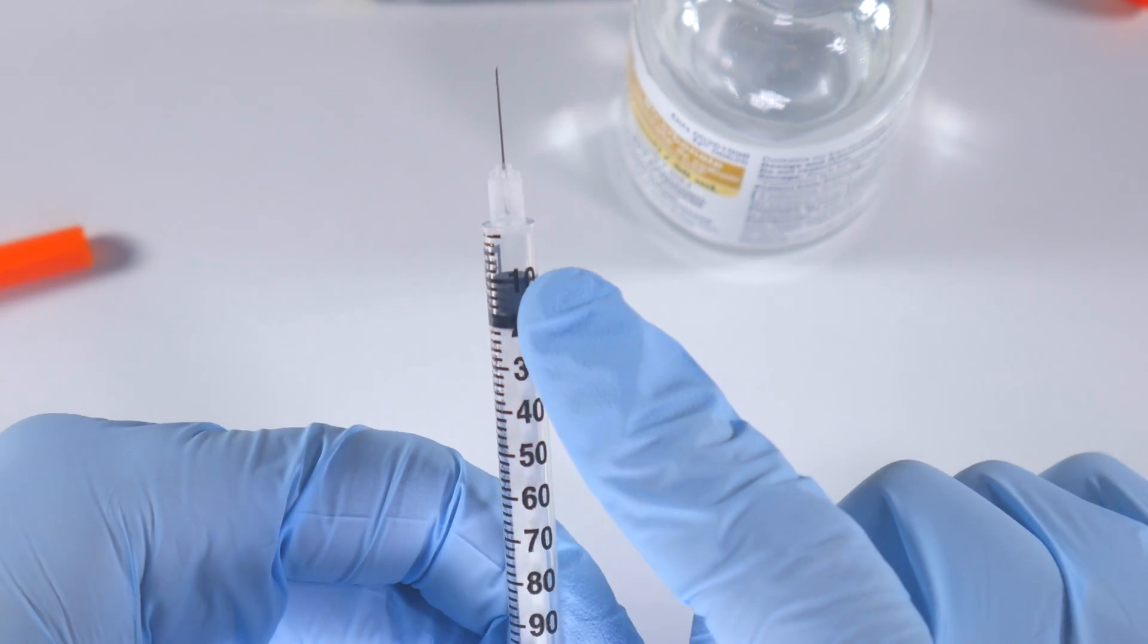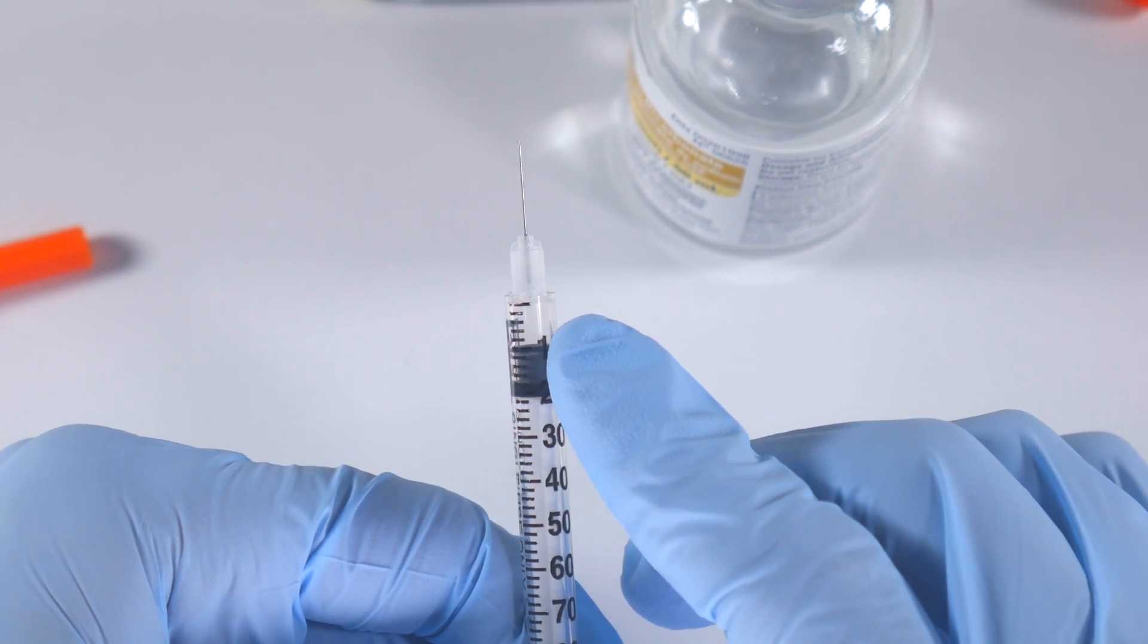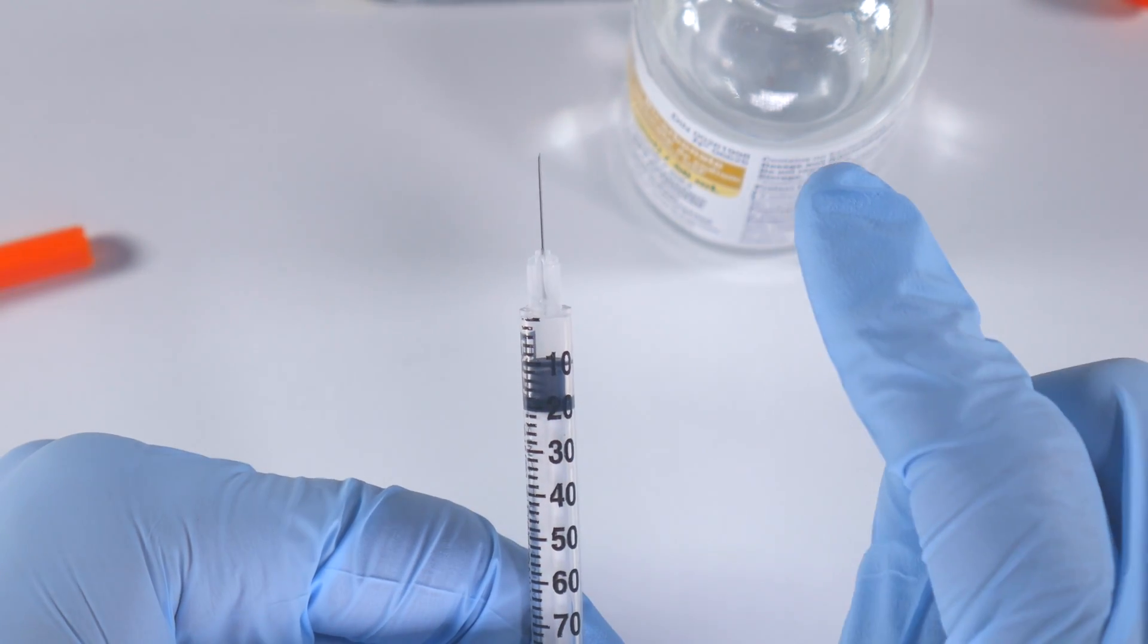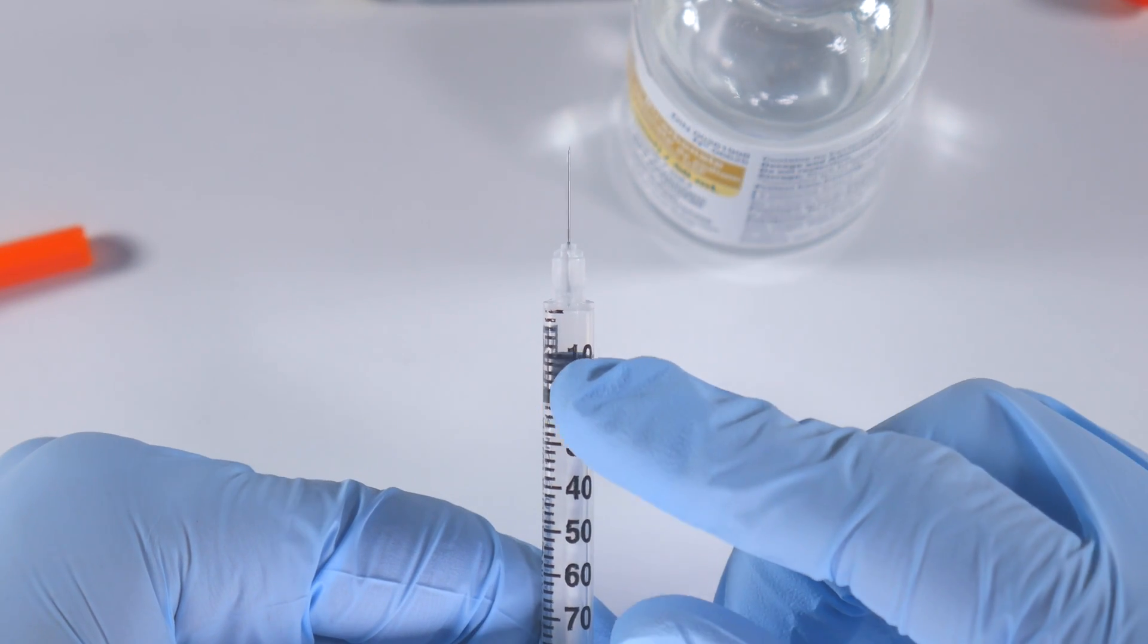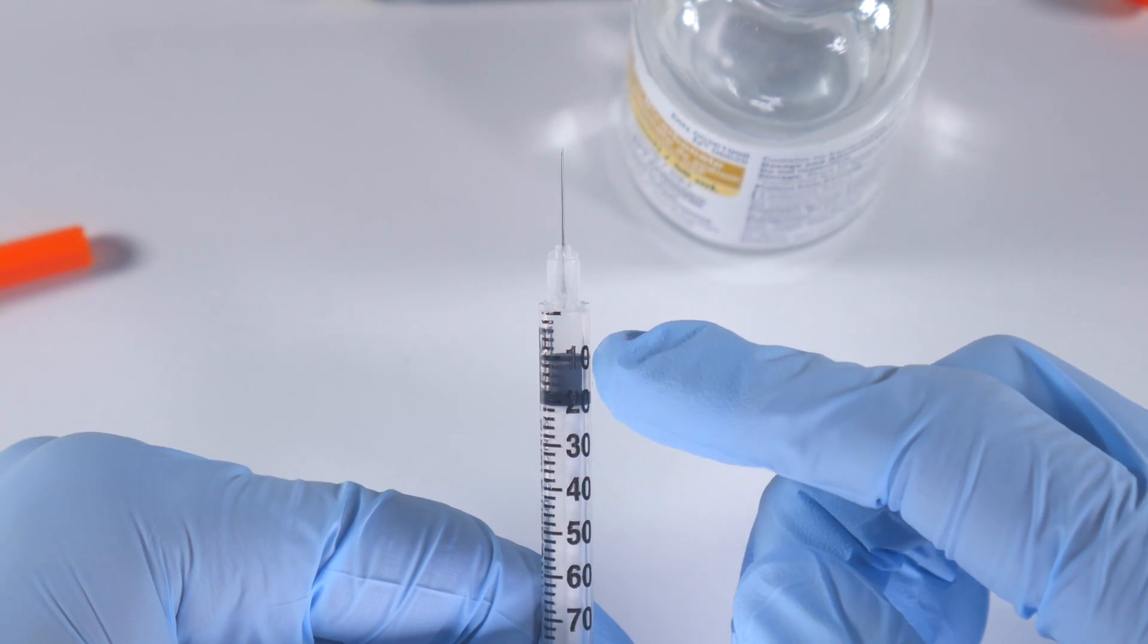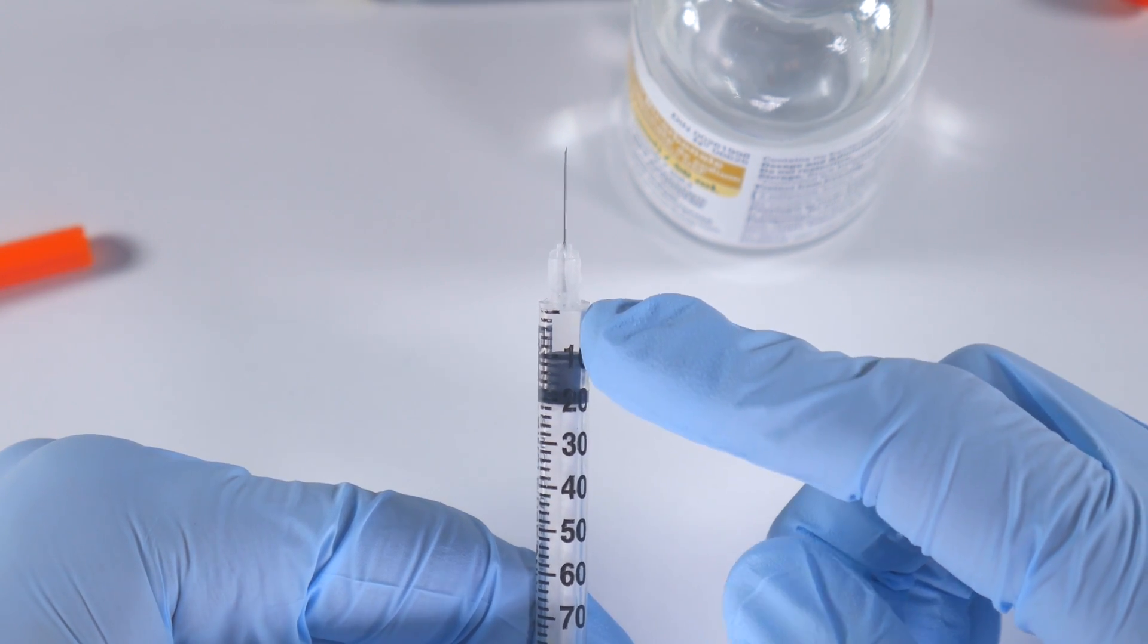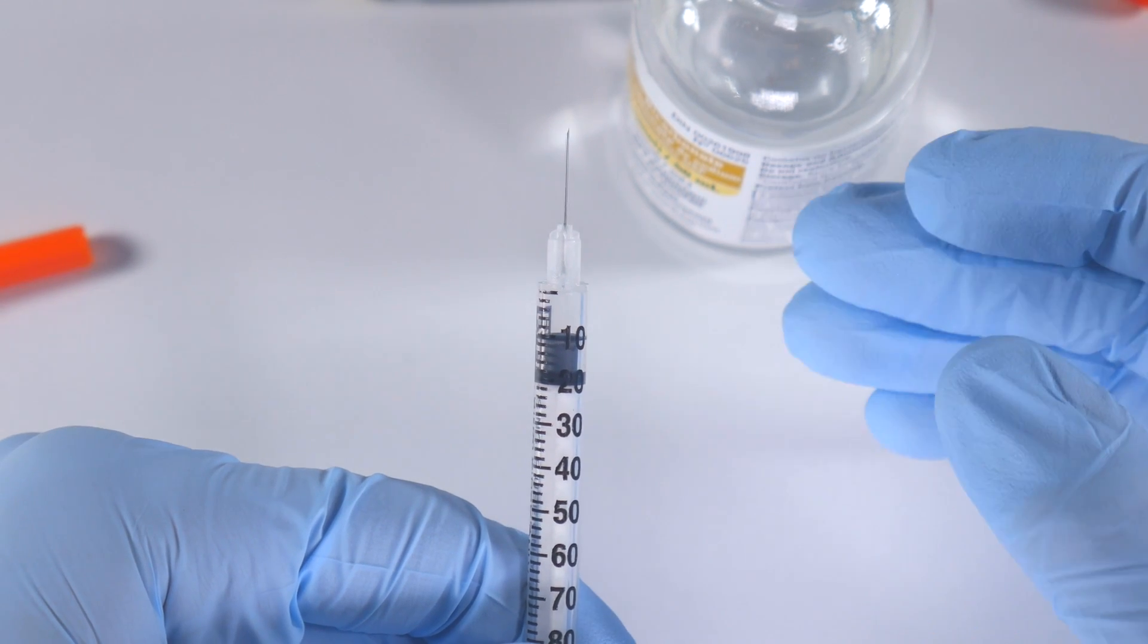So once you draw that back, you're going to then take this, express the air into the vial, and then you're going to draw back again to the 10 on the syringe, which allows you then to ensure that you've avoided any air in the syringe. When you draw back the solution, the sodium bicarbonate, it's not going to have any bubbles within it.